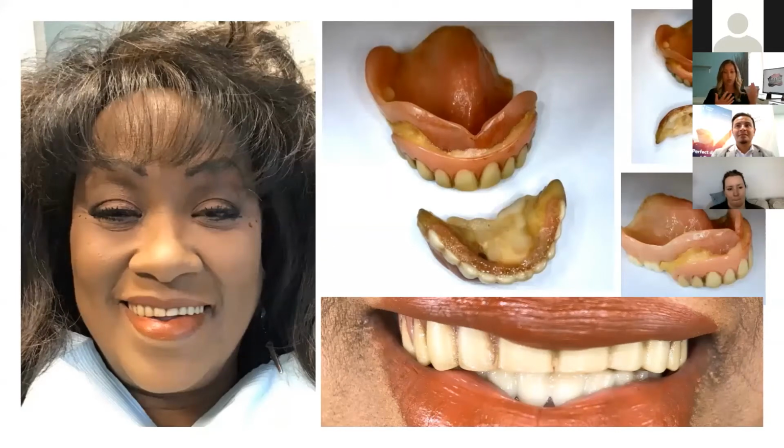So we had a registration of her bite, but you can just see the desperation in her. And this was something that I coordinated with the local dentist to help her out. You can see on this slide on the upper right that she did have some little teeth in there that would have nestled into that makeshift liner. Those had to be extracted, so she was going to be left with a full lower. So the local dentist, I sent him these photos. I called him, and it was the same thing for him.